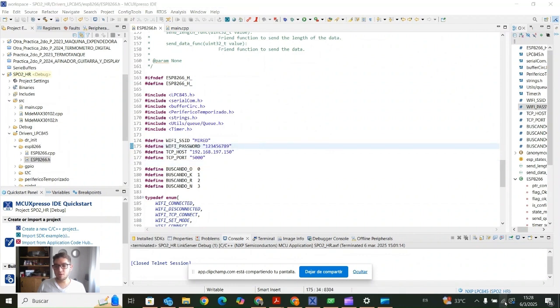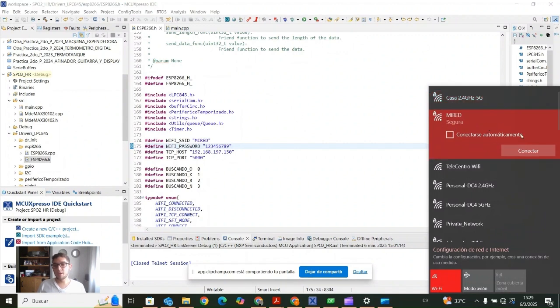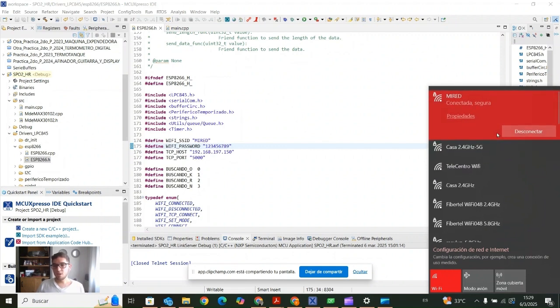So go to Wi-Fi options. We disconnect from the actual Wi-Fi network. Then we pick Mired in this case, whatever your network name is. Then we choose connect. We wait for the connection, and after the connection we go to properties. I am going to show you that. Okay, now we are connected. We can see the connection in our phone in connected devices.